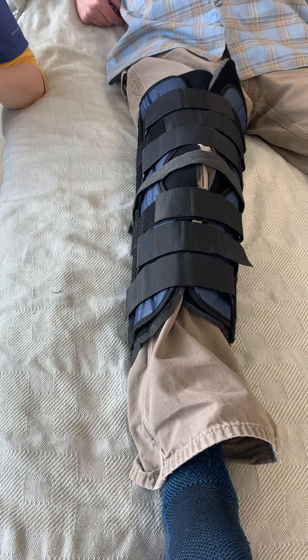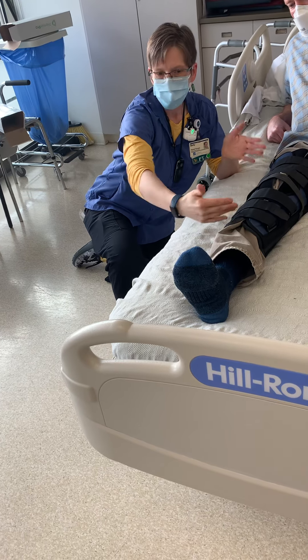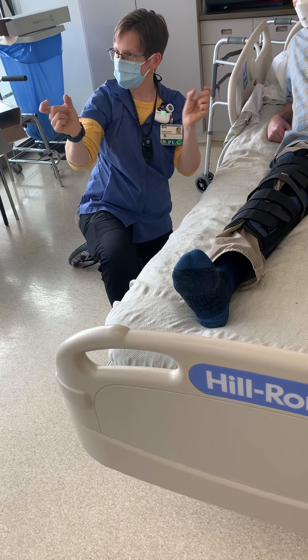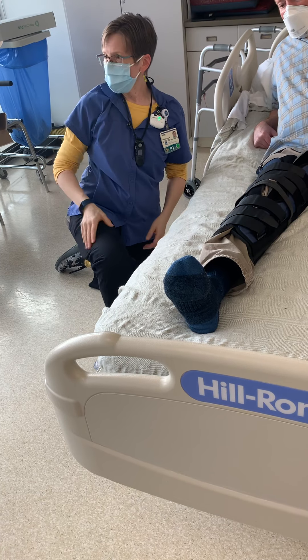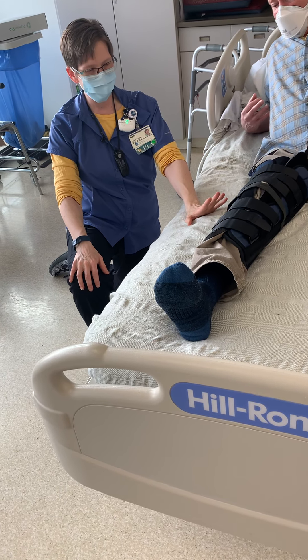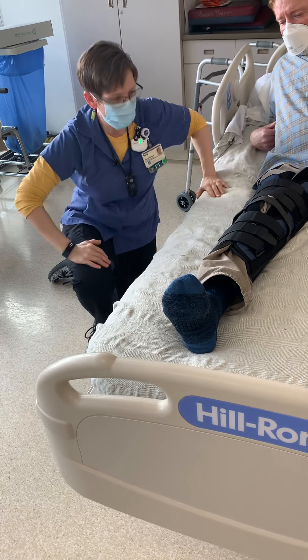Usually I will call the storeroom and say, okay, I've got a person with this length of leg — what length of immobilizers do you have? So say you had a 22-inch leg and they have 19-inch immobilizers — that should be fine. That'll give enough support but also enough breathing room so it's not going to be driving them crazy. I think they come in three different sizes — like a 12, a 19, and a 23 or something like that, though they may have changed a little bit since then.